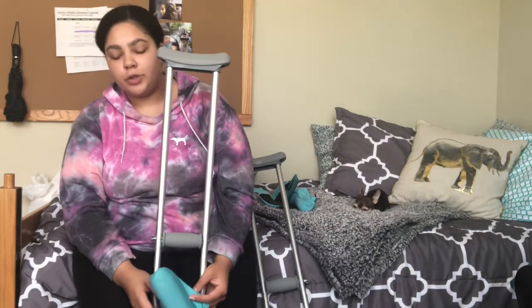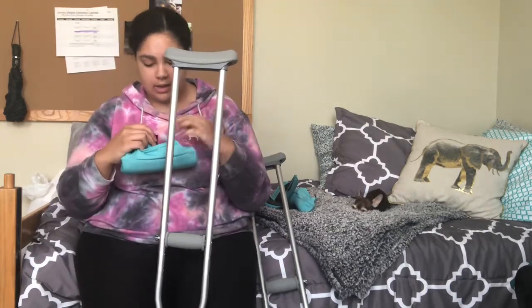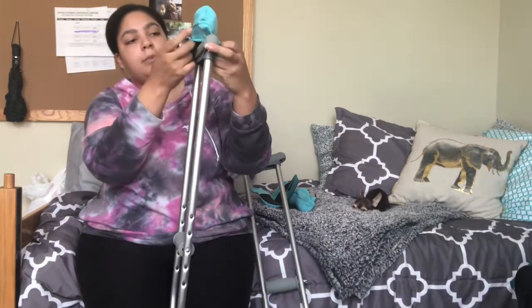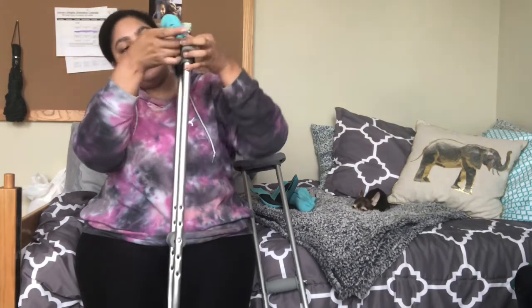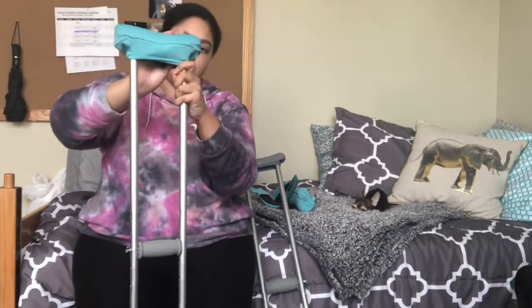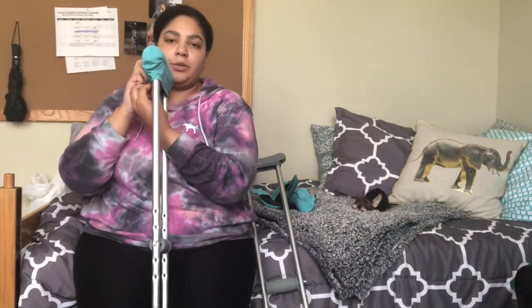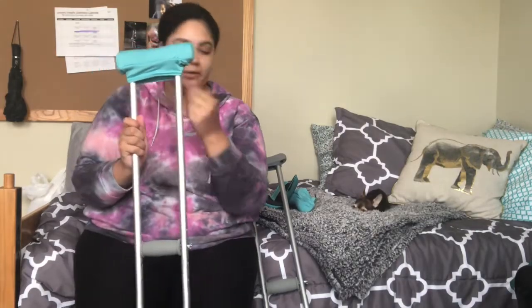I got these on Amazon for about $15 — I picked the ones I liked for the color. You just slide them on the top; mine have little velcro on the bottom. You slide it over and then you have all this extra cushion. I got them one or two weeks after I broke my leg, so it's been about a month.